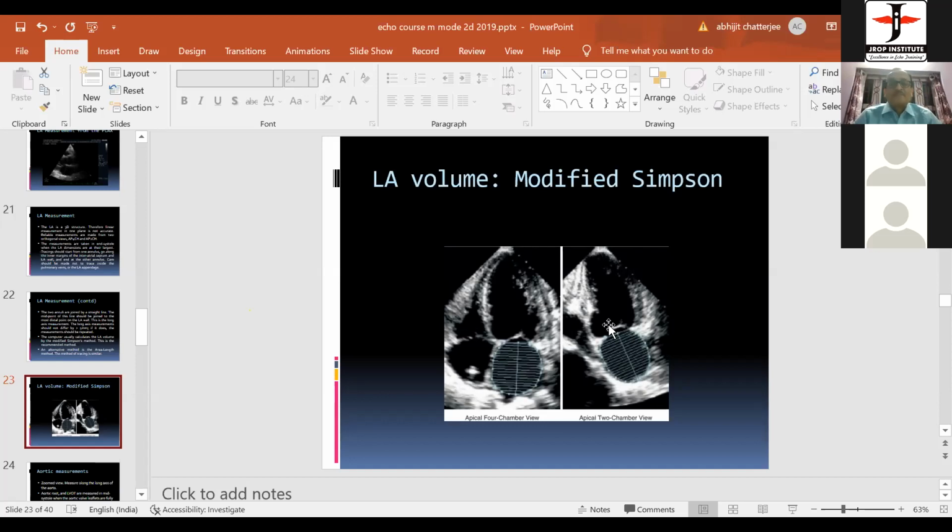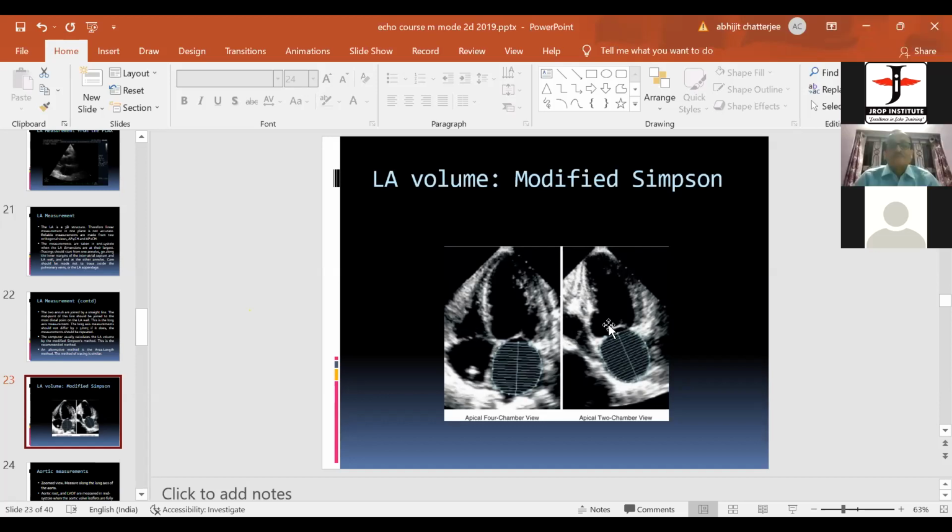We can share a couple of salient points. How do we suspect pulmonary embolism? Sir, we find the RA, RV and the IVC dilated.